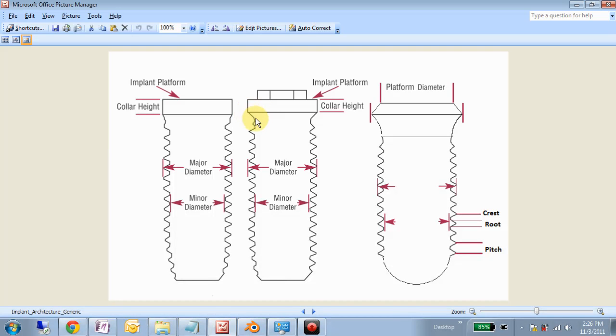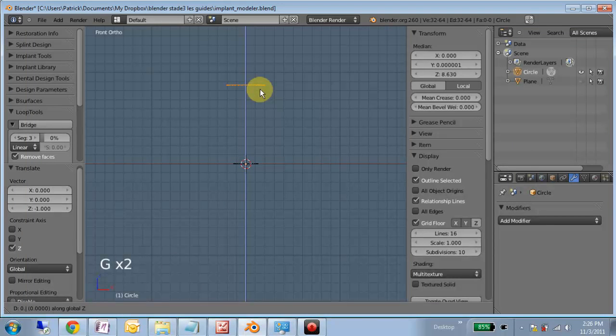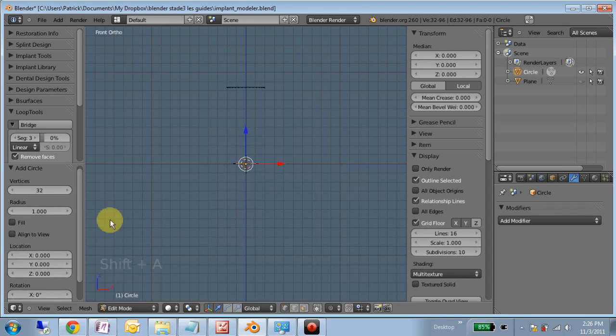If you want a bevel here and not a step, we could then move this down, G, Z, maybe a negative quarter millimeter. Okay. So here we are again. The 3D cursor is still at 0, 0, 0. I'm going to add another circle. This time I'm going to make it 2.05. So that's 4.01 diameter.